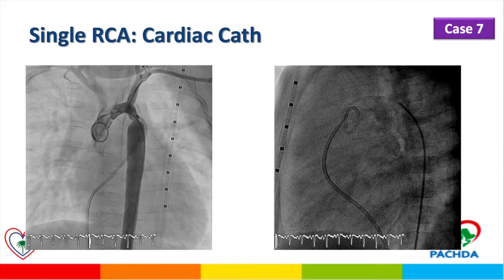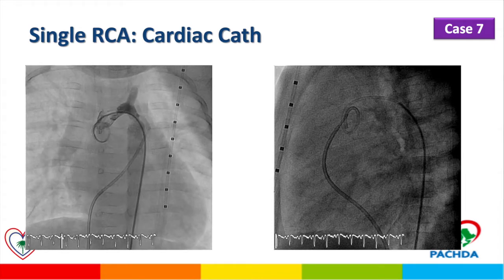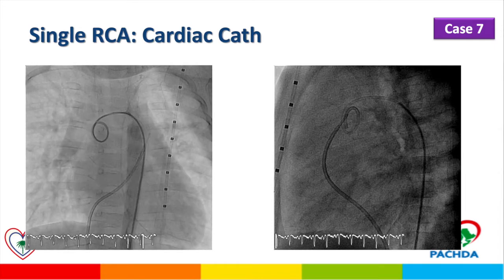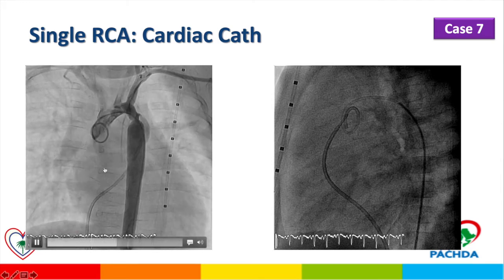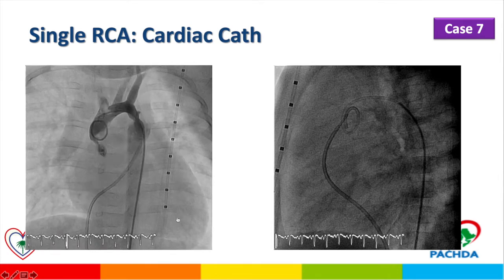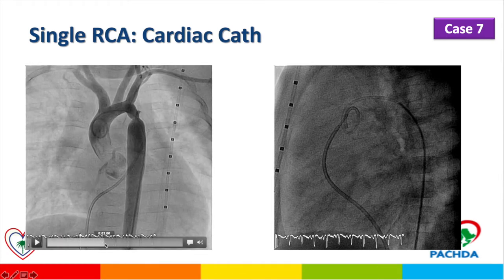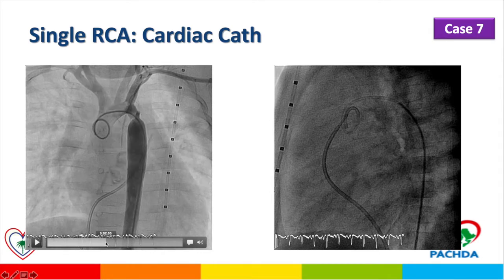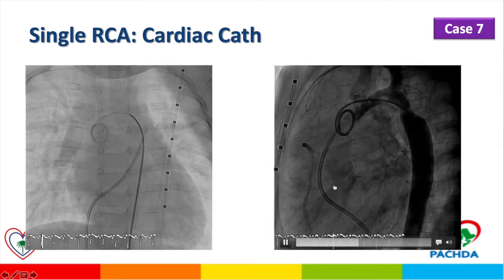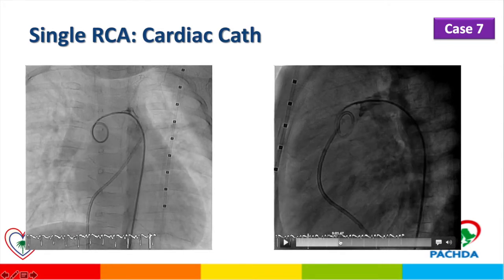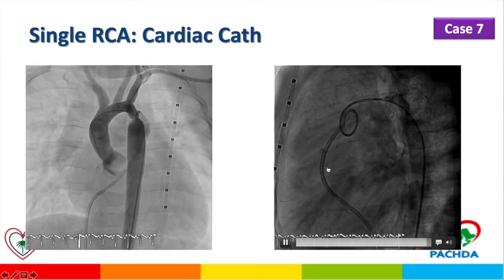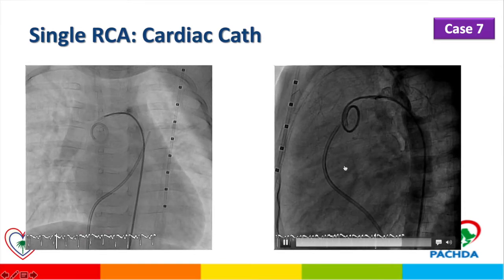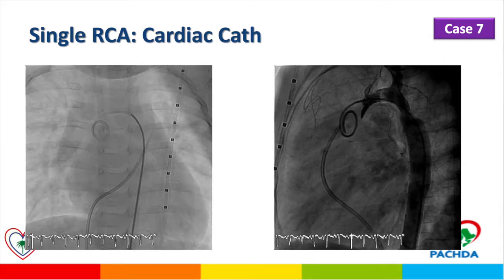This patient presented with coarctation of the aorta. When we took the patient for cardiac catheterization as treatment for his coarctation, we did an angiogram to look at the ascending aorta and coronary artery abnormalities. At the beginning of the injection, the right coronary artery and left coronary artery are coming from the same side. The lateral imaging confirms that the right and left coronary arteries are coming from one origin. So this patient has a single right coronary artery in addition to his coarctation of the aorta.